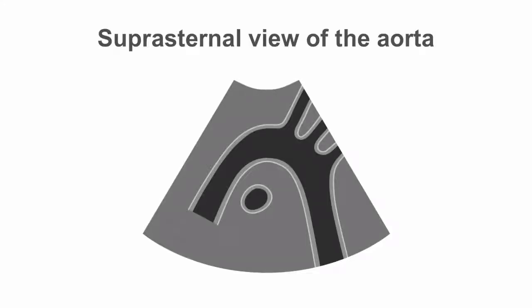This is a diagram of the suprasternal view of the aorta. Our probe will be at the top of the screen here. We're looking at the ascending aorta, the arch itself, and then the descending aorta here. We also get the head and neck vessels. So this first one is the innominate. Some people call it the brachiocephalic artery. Then we have the left common carotid, and then we have the left subclavian. Sometimes you can see the right branch of the pulmonary artery beneath the arch.